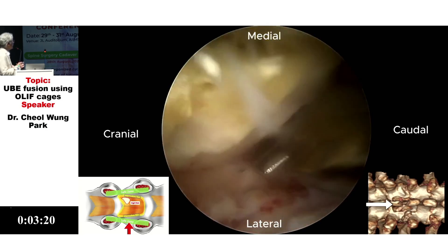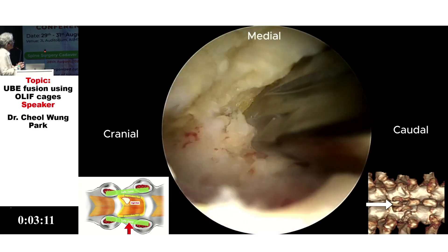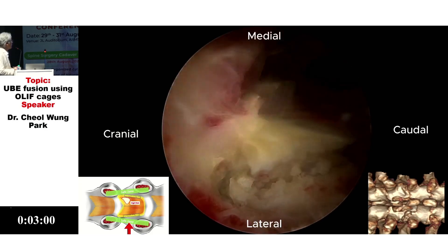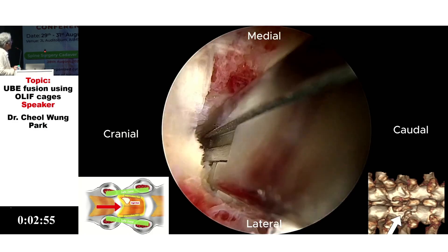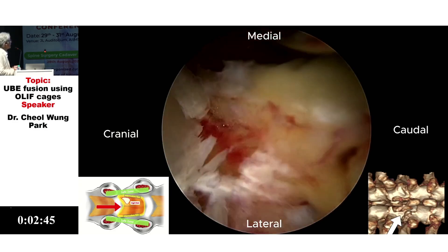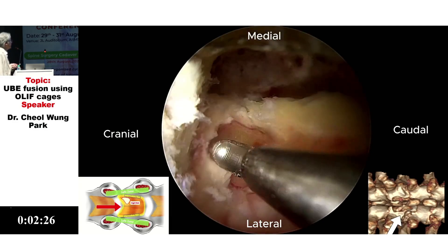From the proximal margin of the distal lamina, you can follow it and expose the medial wall of the SAP. Then we go to the no-compression zone, where you can place a 1mm punch. You then separate the ligament from the bone — here in the cranial area, and also on the contralateral side in the middle area.